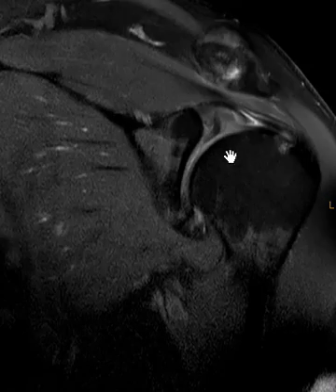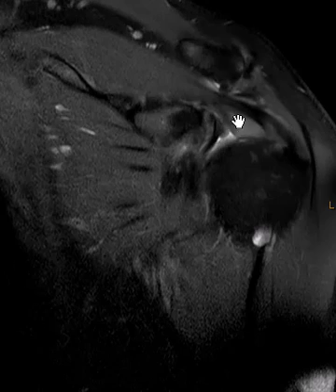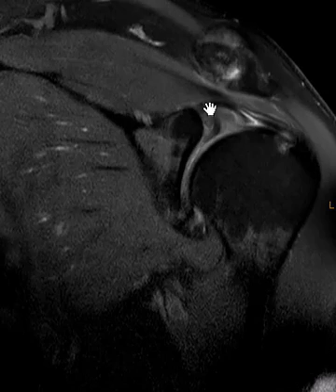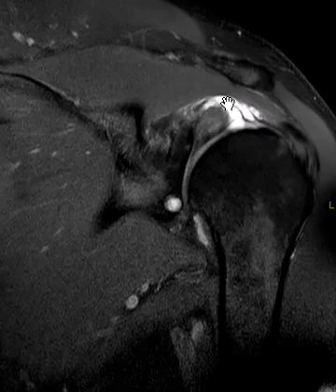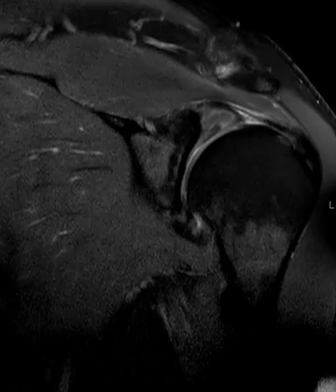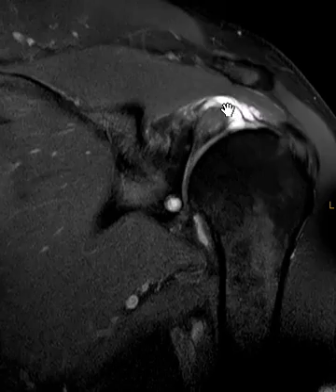If we go to another view, we see this large expanded superior labrum. This is the biceps labral anchor here, this is that superior labrum. If we go posteriorly, there's a huge expanded superior labrum. They have a septated fluid collection here that looks like a paralabral cyst — mucoid degeneration with this cyst. This reminds me of the ACL, where you can have a large ACL that's expanded with an associated ACL cyst, or similarly in the meniscus where you can have a big expanded meniscus with a meniscal or parameniscal cyst. This is something I usually don't see within the labrum — the same appearance of mucoid degeneration with expansion and an associated cyst.